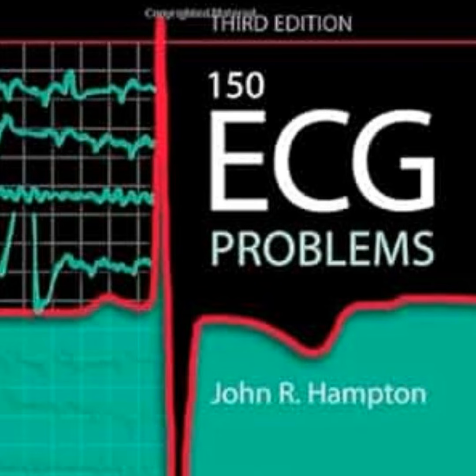So in this case, the tracing shows a broad, complex tachycardia. It's a highly unstable heart rate, somewhere between 130 and 200 beats per minute. Extremely fast. The baseline is completely irregular, and it exhibits a left bundle branch block pattern. Now, the immediate assumption would be, what, a massive primary structural heart defect, or maybe severe primary ischemia. Sure, that would be the horse. But the underlying etiology for this tracing was actually syphilitic aortitis.